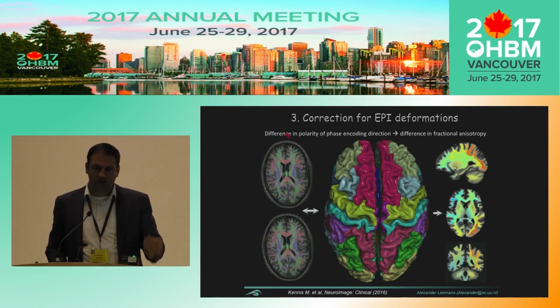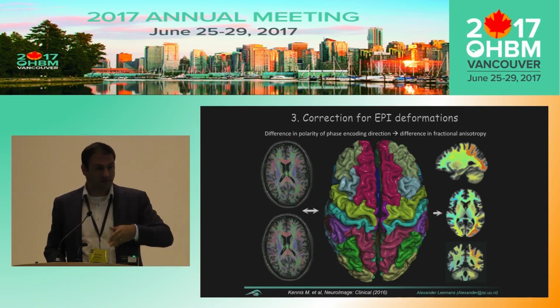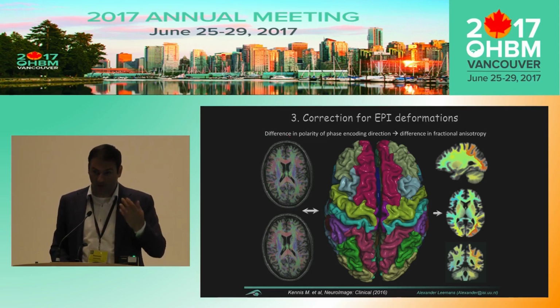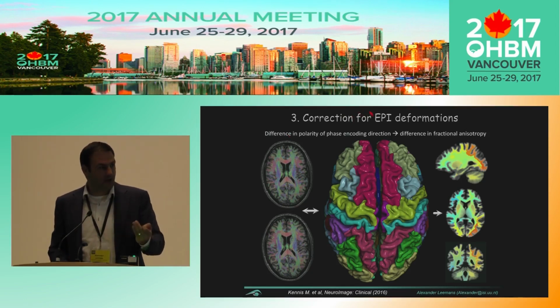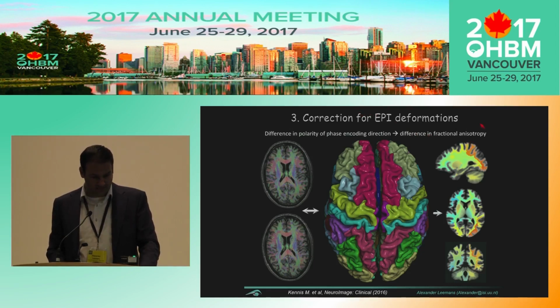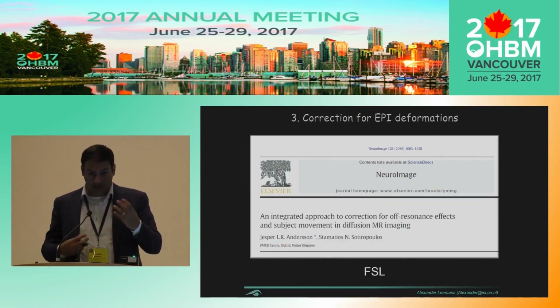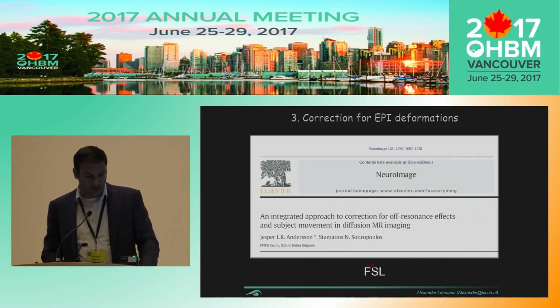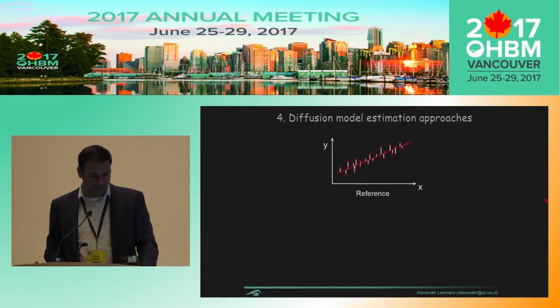And interestingly, if you change the phase encode, or the polarity of the phase encoding, you can still see differences in your final outcome. Okay, so even after correction, you can still observe these differences in the final outcome of your analysis. And obviously, if you do have phase encode data acquired AP and PA, then I would recommend using the FSL tool here to combine everything and get rid of the artifacts here.